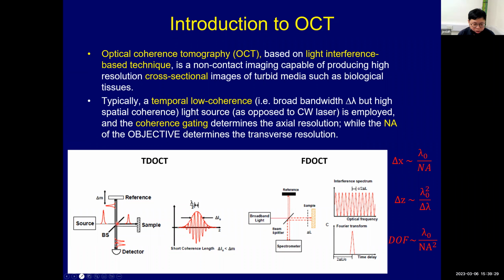When they recombine at the detector and travel the same distance, they give you this kind of interference pattern, which is a very powerful method that allows you to measure the distance of your object.